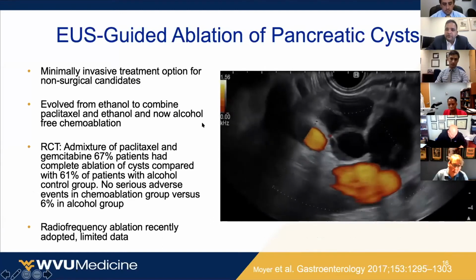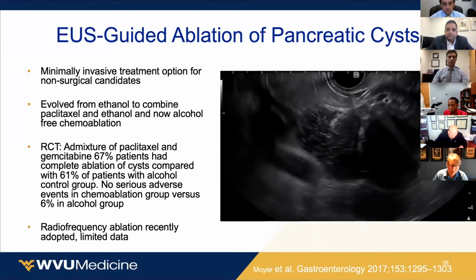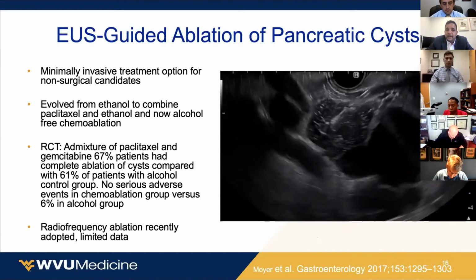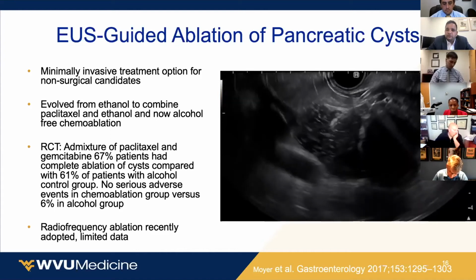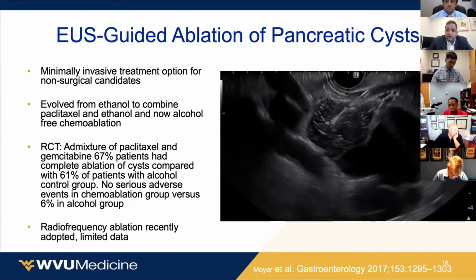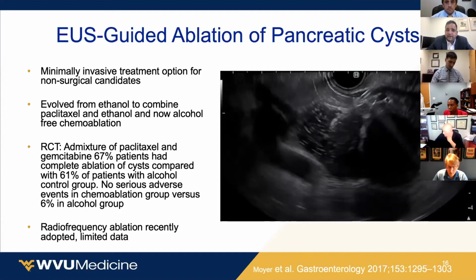Recently, many advances have been made in EUS-guided therapeutics. EUS-guided ablation of pancreas cyst is a minimally invasive treatment option, especially for patients who are not surgical candidates. It avoids systemic toxicity of these chemotherapeutic agents and provides high concentration of chemotherapy drugs locally within the cyst.